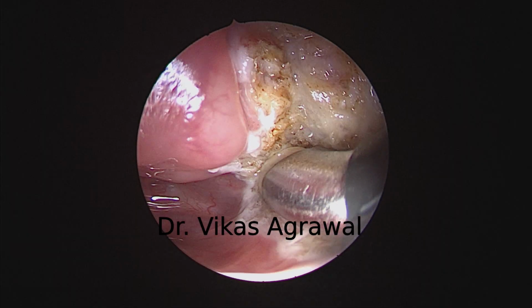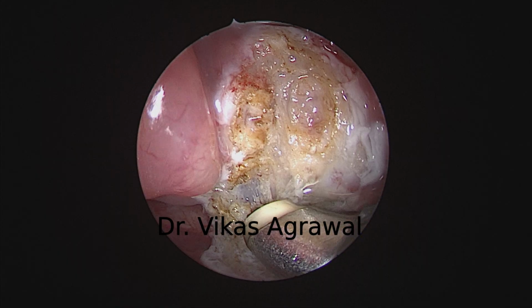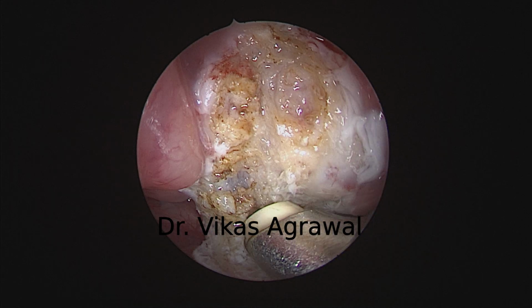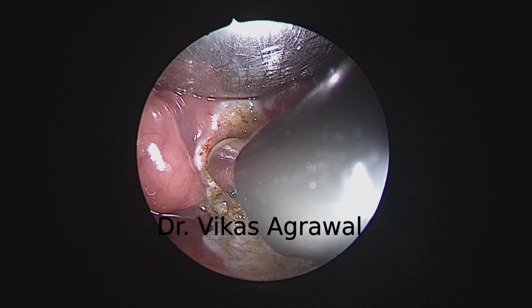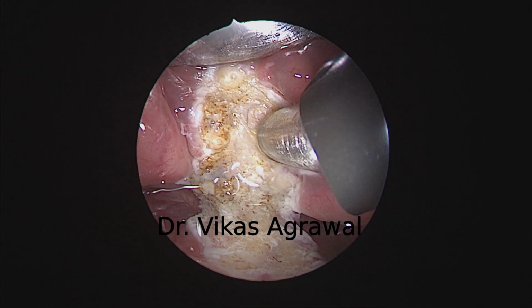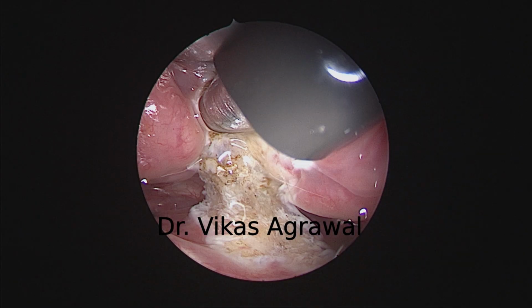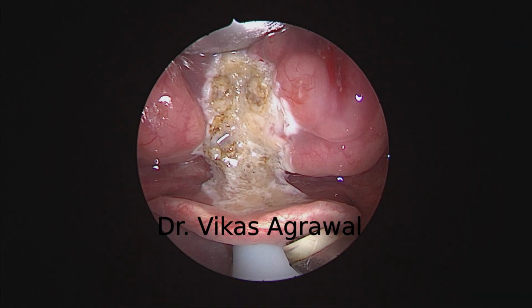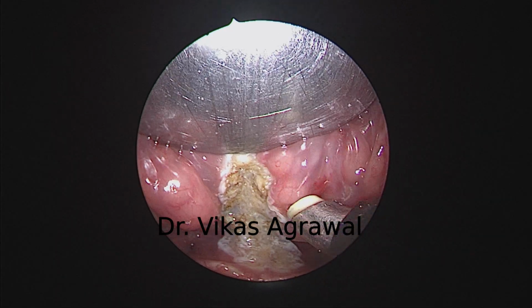Just not happy with this lymphoid tissue, but I do not want to get into the vessels. If I go deep here, I'll get into the vessels. That can bleed, so I'm just restricting myself. Alright, so this is a less than 10-minute surgery, which changes the fate of this patient who was unable to tolerate the CPAP also. Absolutely maintained BMI. He cannot do a sleep study because of the sleep apnea. And I'm not even removing all the lymphoid tissues from here.